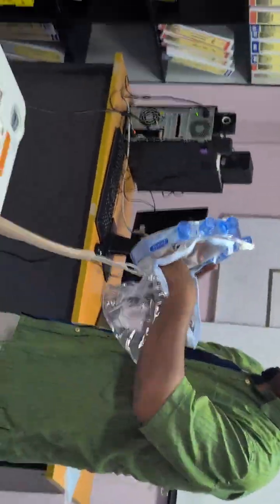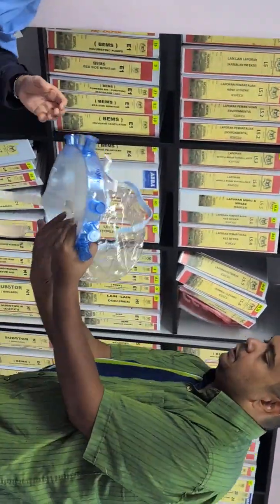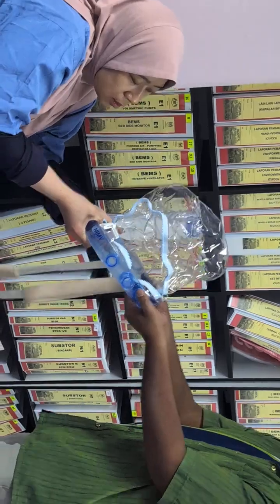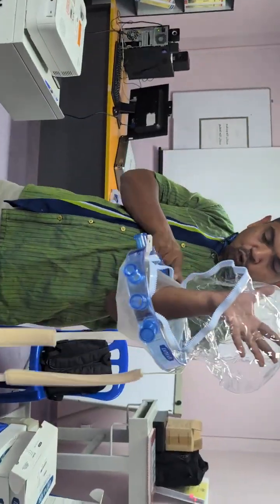Okay, and to put it on here, one person cannot, it needs two people. Alright. So doctor, do me a favor. You pull the plastic. Pull as hard as you can. You pull this, put it inside the patient. Okay, then thanks. The moment the patient is inside, don't close this first.